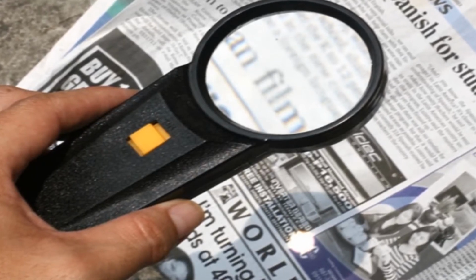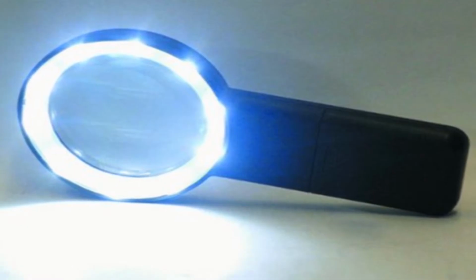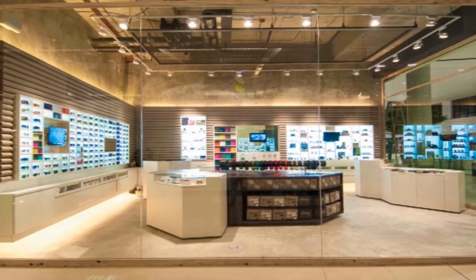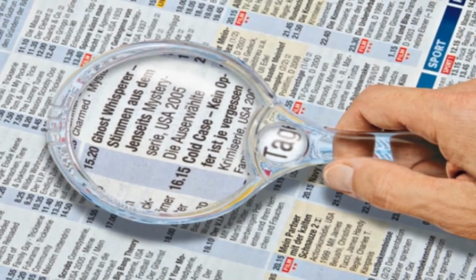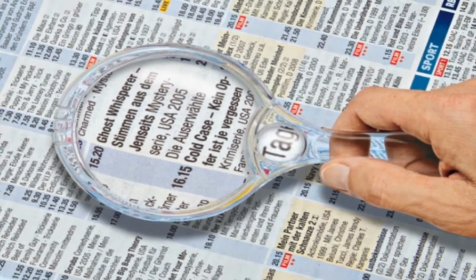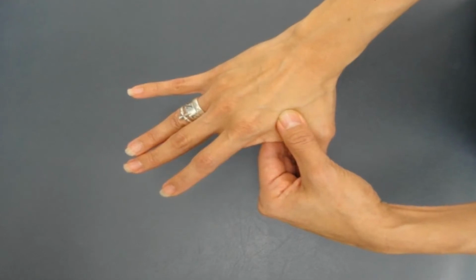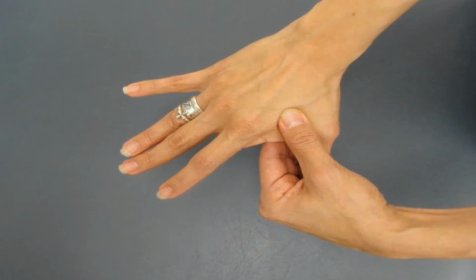It is an excellent device for spot viewing and is available as self-illuminated and LED forms. These are inexpensive and readily available in the market. The disadvantage is that one hand is always blocked while using it. It is not useful for prolonged reading. Hand and arm fatigue is found to occur with extended use, especially in children and persons with hand tremors.